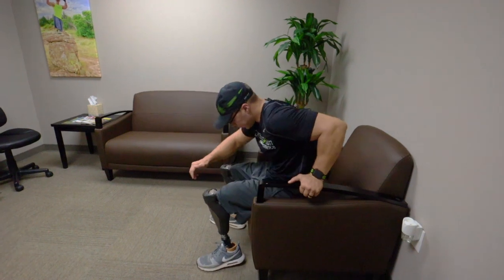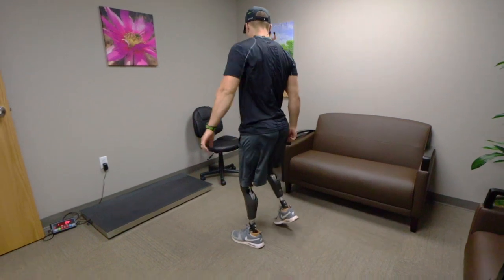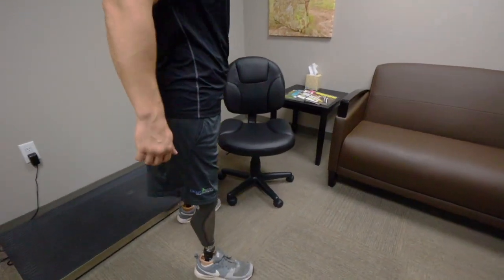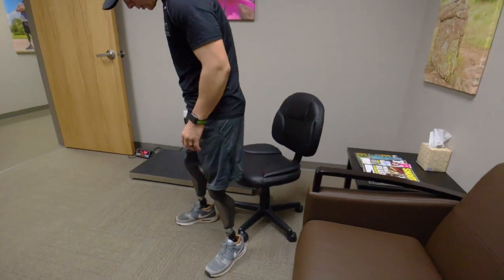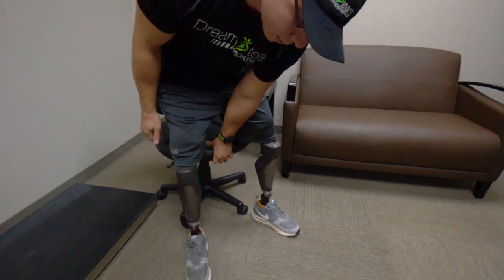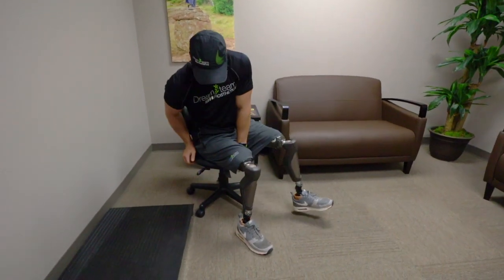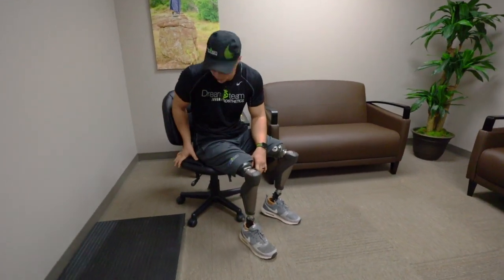Again, you can use just one arm to help yourself get up or sit down, whichever arm you prefer. And whenever you get a little bit better at it, you can utilize the rolling chairs — desk chairs, office chairs. These are a little bit trickier, and what I do is I will actually bend down and grab the seat right here in the middle and then just kind of hold it in place, and that's how I sit down in one of these.